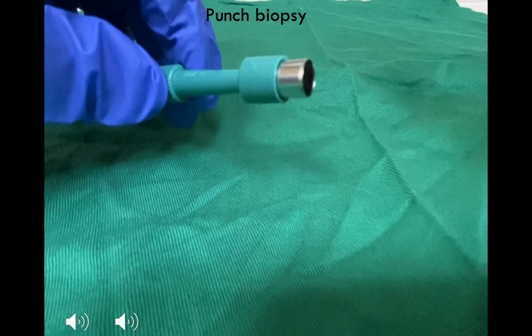In this case, punch biopsy can be done at sites having sufficient thickness. Areas such as hard palate or gingiva would not be suitable, as closure would be slightly difficult.